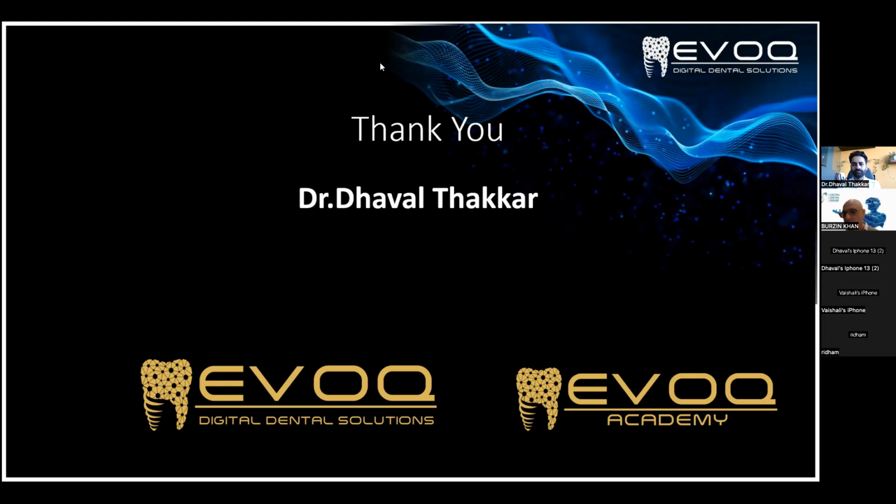Most of these mock-ups that you do, are they 3D printed or milled PMMA? Basically, we first do the 3D printed mock-ups, which are tried in the patient's mouth. Once it is okay, we do the milled PMMA for the patient to wear for a period of around 10 to 15 days minimum. Only then do we go with the final prosthesis in PFM or zirconia. So a second scan is taken of those prostheses in the mouth to superimpose and replicate them. Yes, sir.